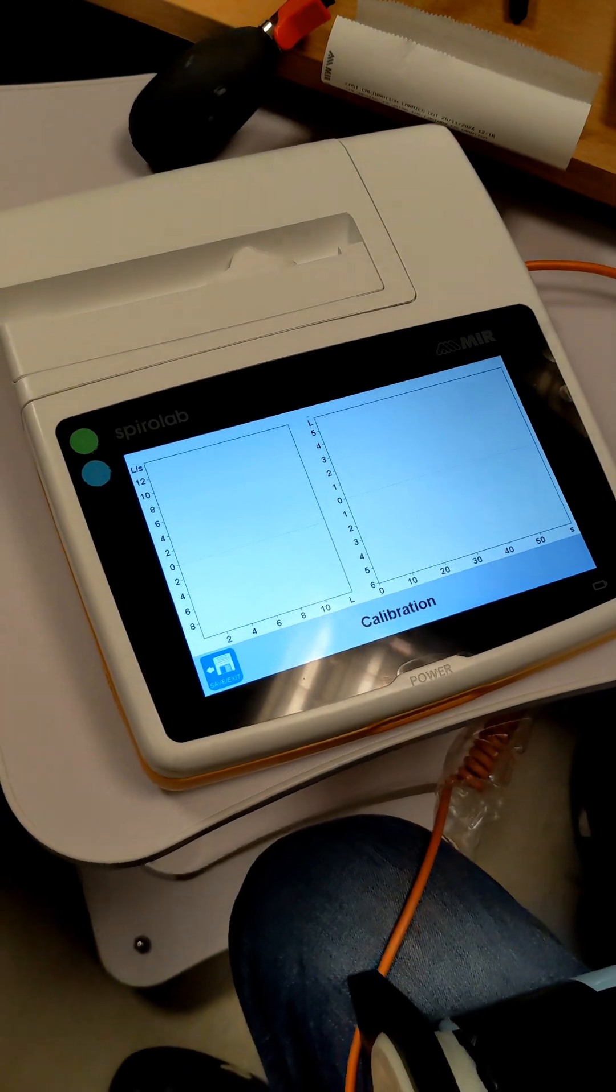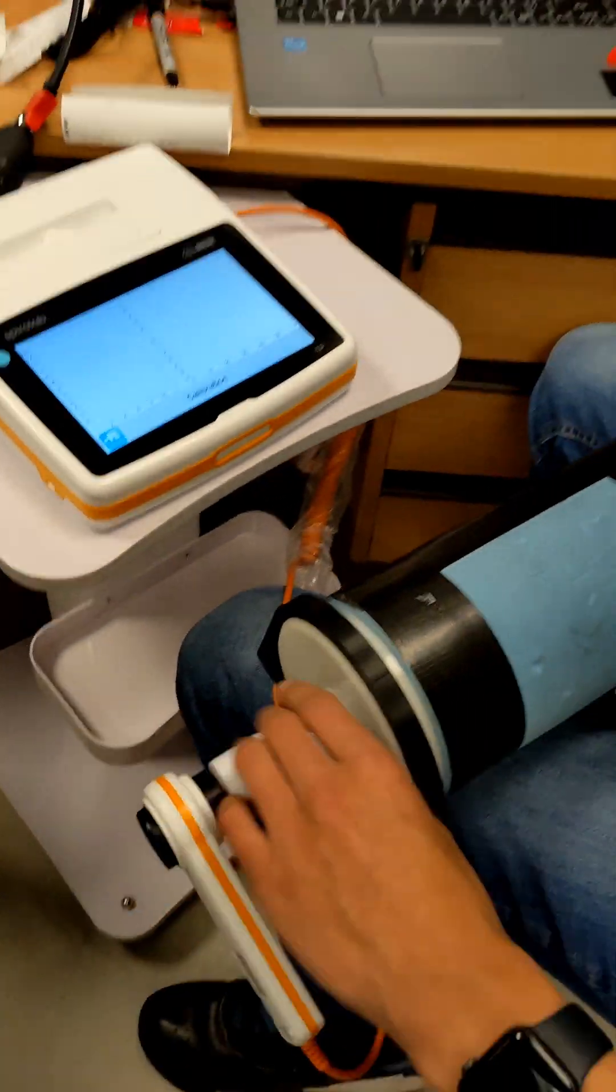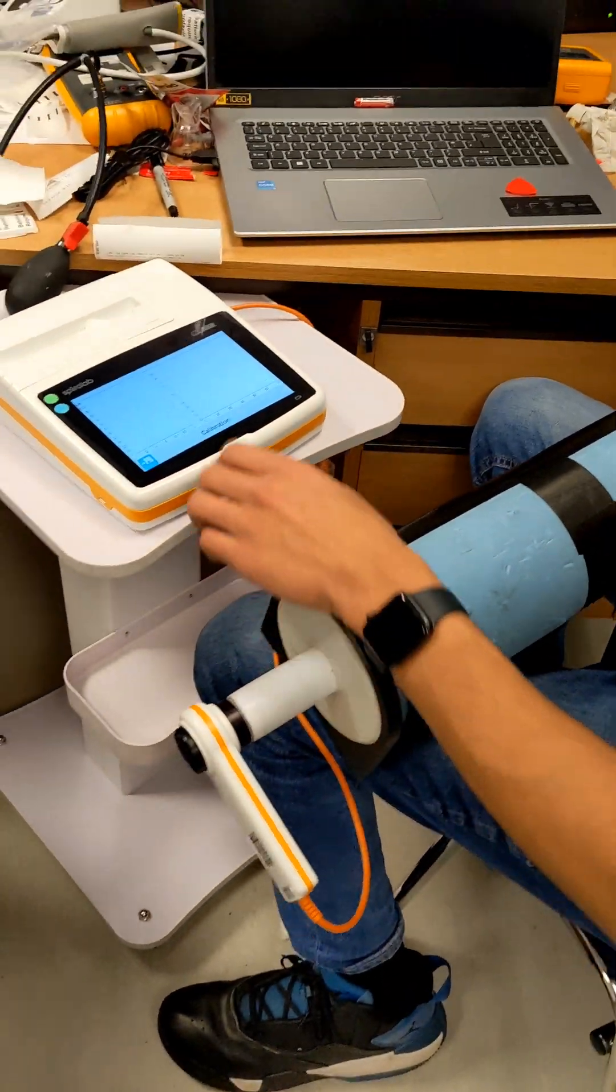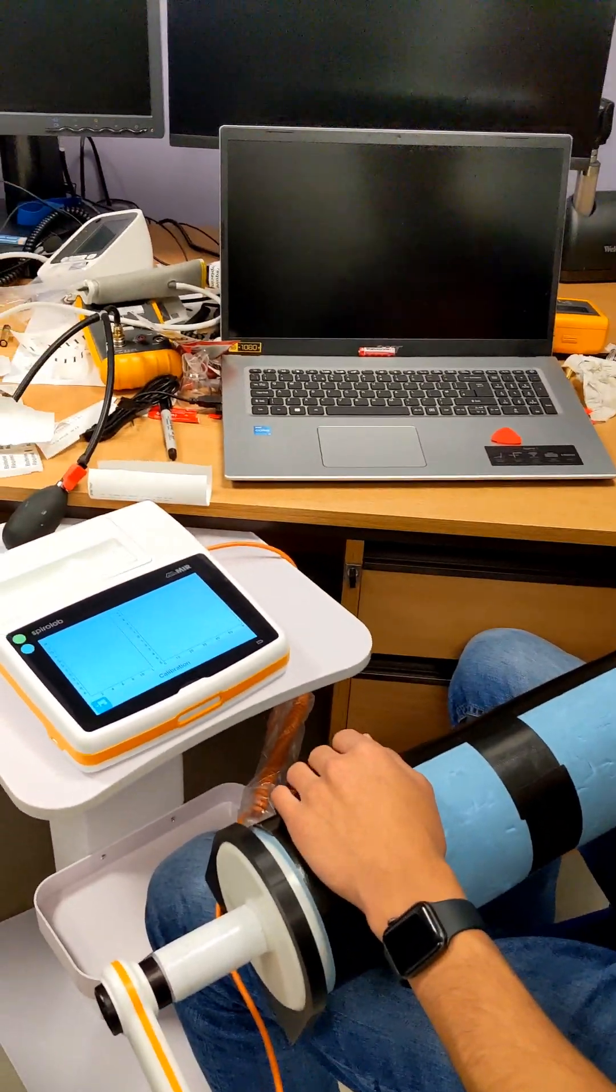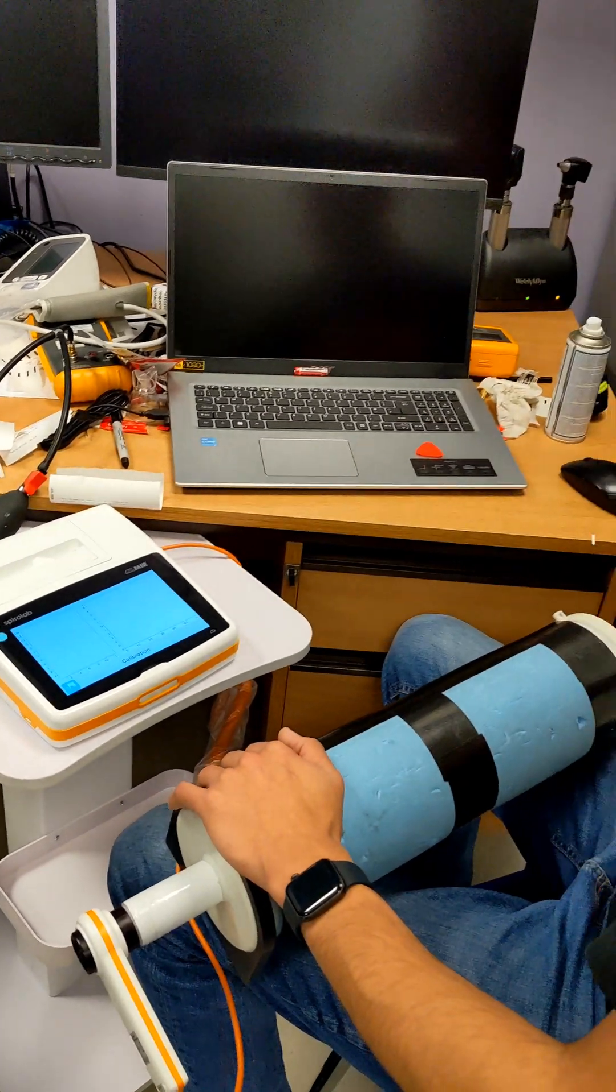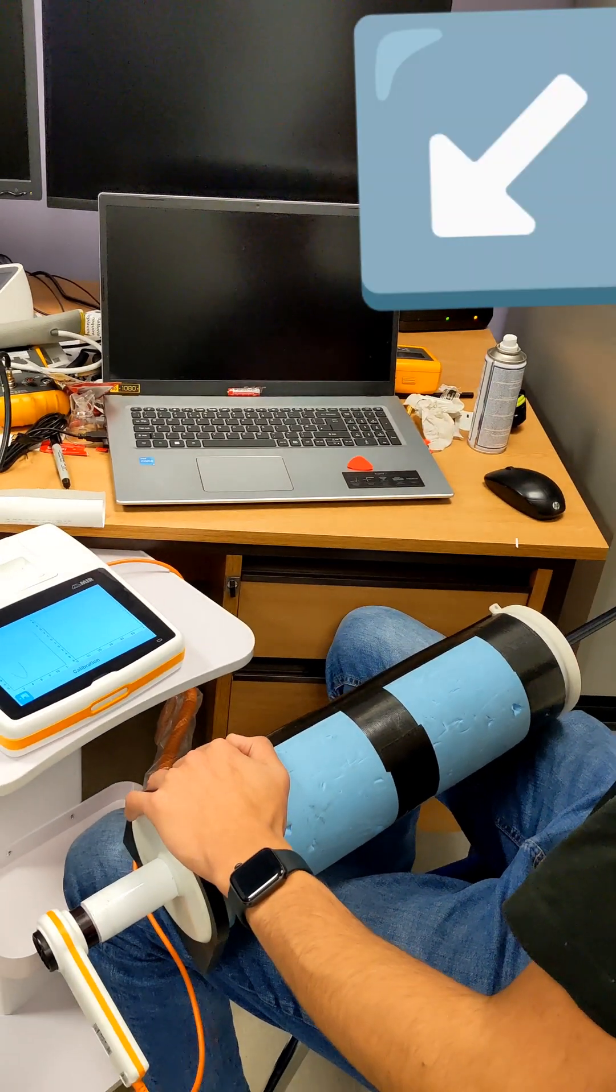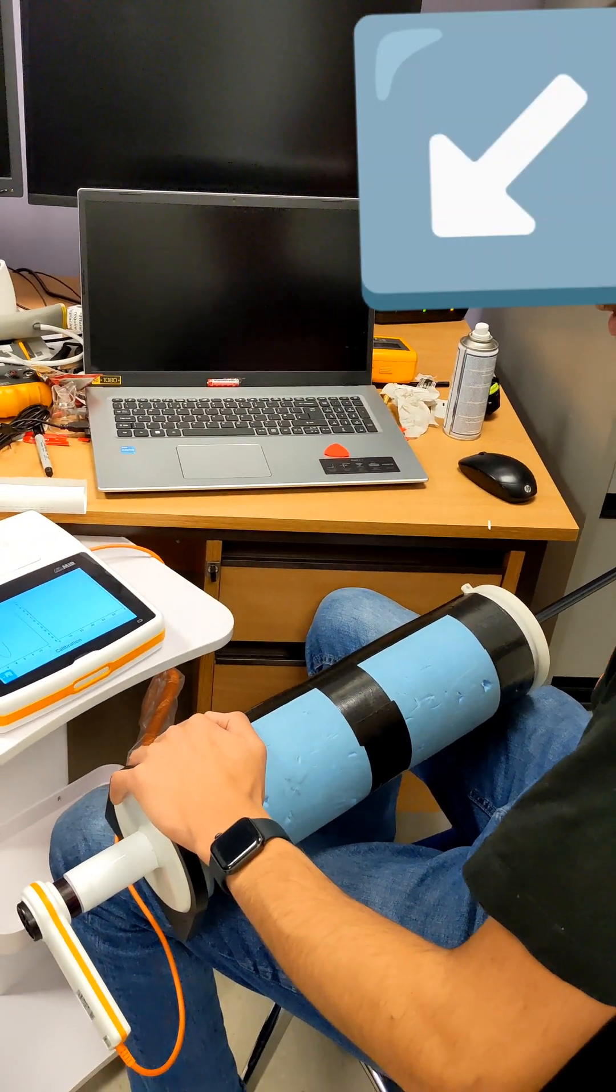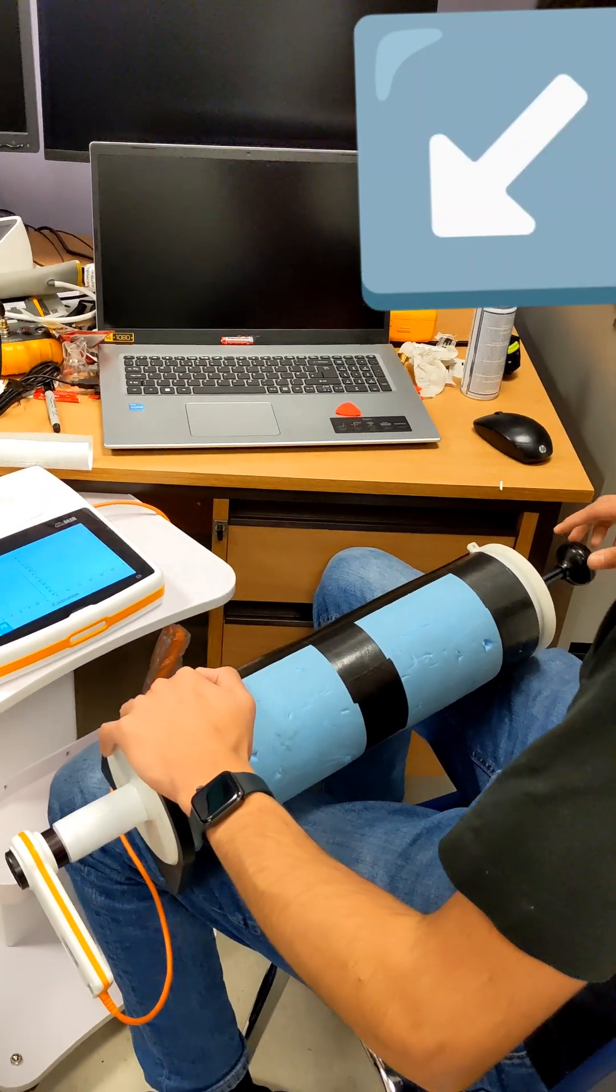Now you connect this to your syringe. On this, there's no restriction on how fast you have to do it. You do it at the normal speed. So you can just do this a few times.